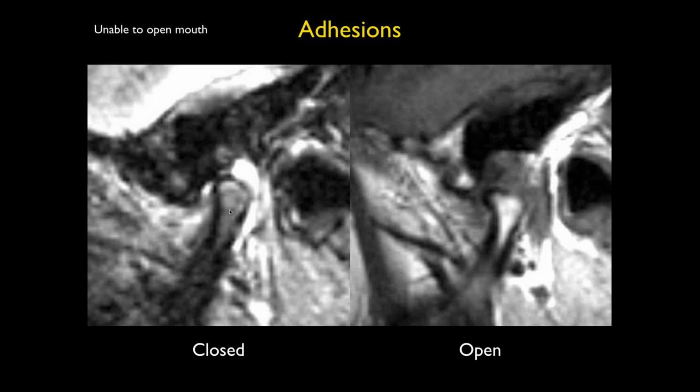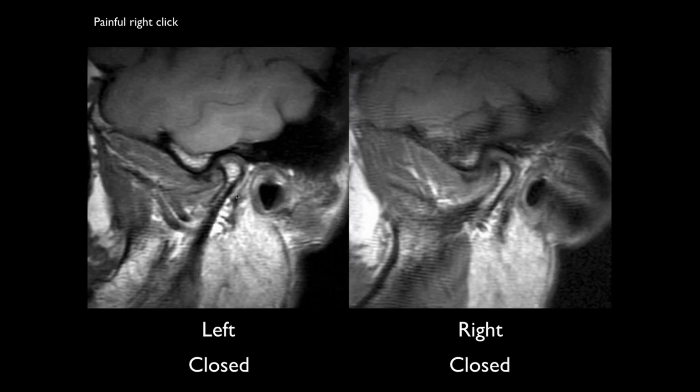Was this guy a boxer? I do not remember, John. This was a long time ago. Okay. So where are the actual adhesions? You often cannot see them, but they're typically all around the head.